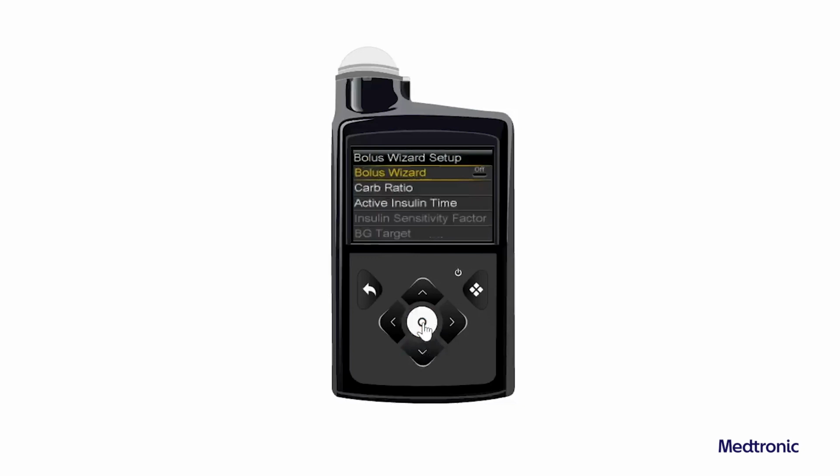The Bolus Wizard Setup screen appears. Select Bolus Wizard to turn on the feature. If this is the first time the Bolus Wizard feature has been turned on, the Bolus Wizard screen appears. Confirm the values needed are ready to be entered, then select Next. The carb ratio 1 of 4 screen appears. Select Next. The Edit Carb Ratio 1 of 4 screen appears.